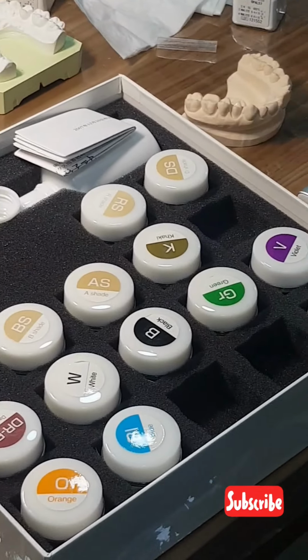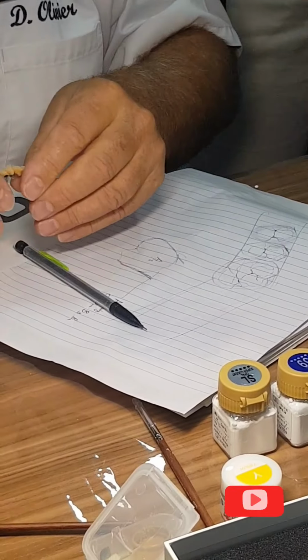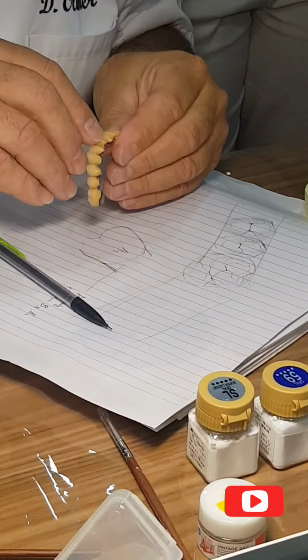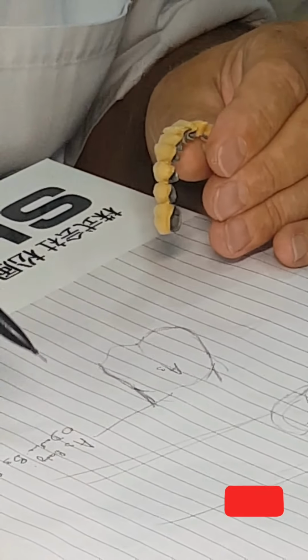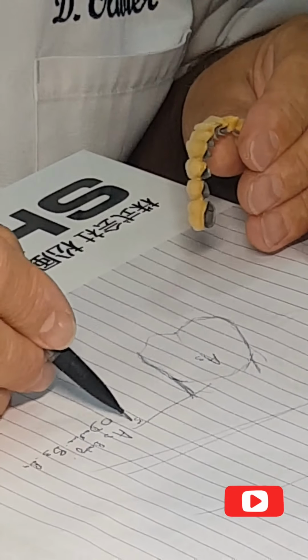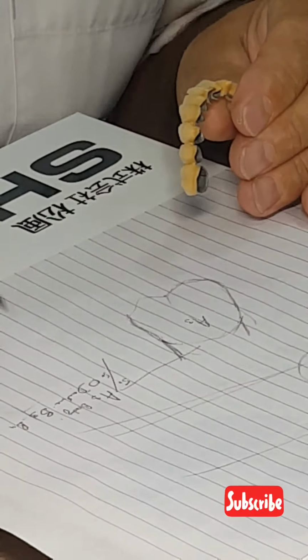to give one shade. Can you give me my master model? Yes. You see that shade here of the root? I include that kind of orange-brown. We find it in the mouth very often. So I repeat, for the root, I start from my shade, opaque dentine, and I'm going to add a very small quantity, tenths, of orange brown.